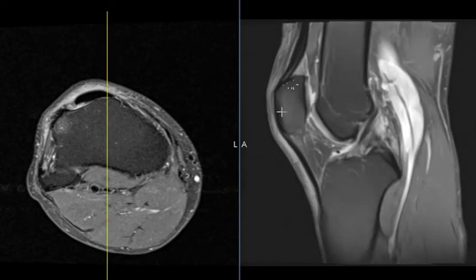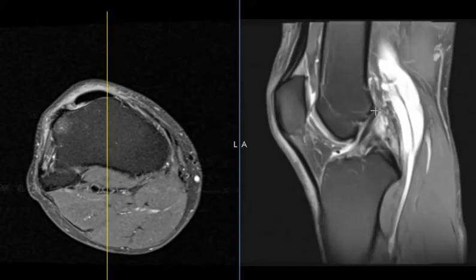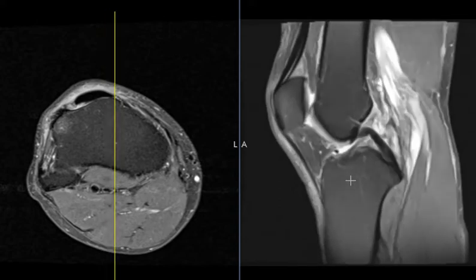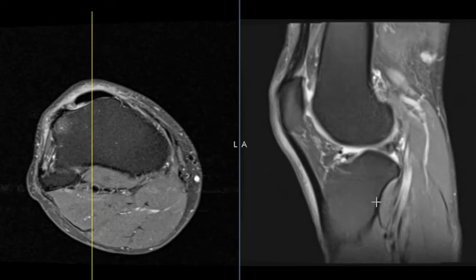In the sagittal view we see the kneecap, we see the femur, we see the tibia, and we see the ACL looking great. And we're going to go over towards that bright signal.